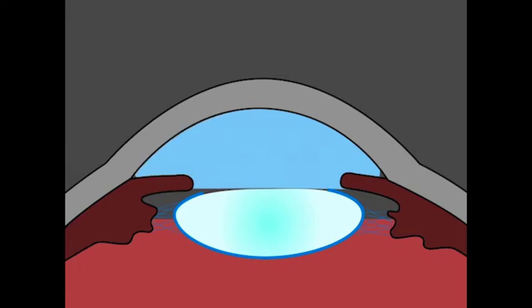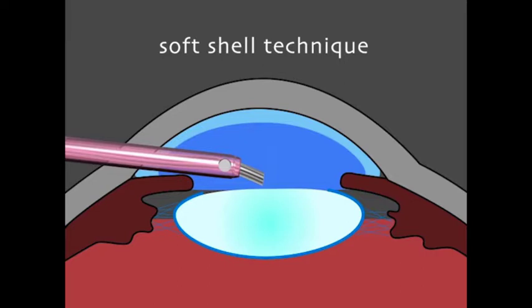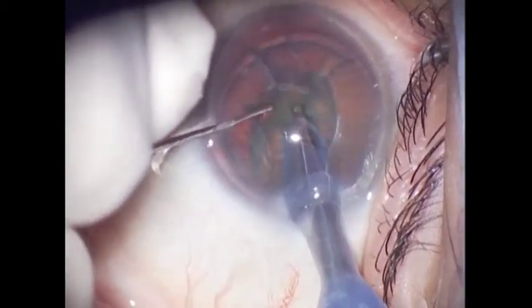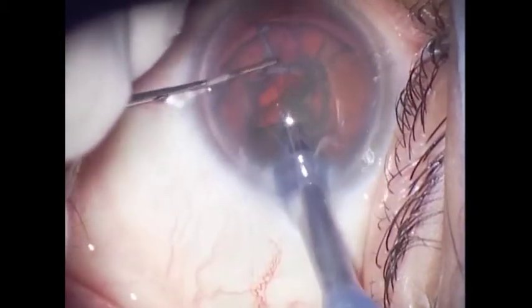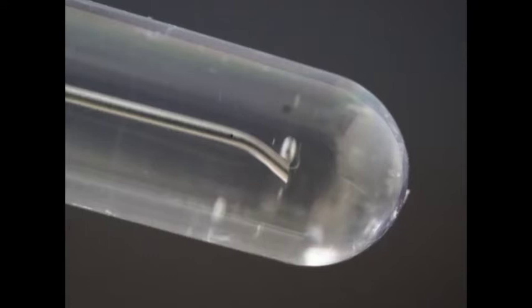The viscoelastic Viscoat soft shell technique is commonly used to protect endothelial tissue from nuclear fragments spattered during PEA. This shell can also be used to absorb free radicals and convert them into stable compounds. To verify the technique, we simulated the anterior chamber of the eye with a Viscoat shell up to the red line.